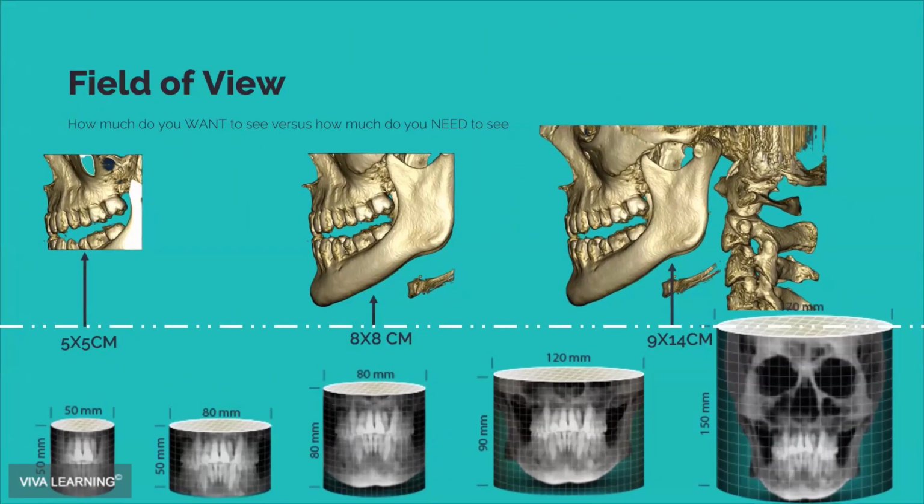Though I will tell you that in my practice, any new patient that I've never met before does get a full scan. Even if they're coming in for one problem area, I want to at least get a full scan of both jaws and sinuses so that I can find other things. It's amazing the amount of dentistry you will find in a CBCT if you take the image and read it. A lot of asymptomatic endodontic requirement kind of teeth as well.